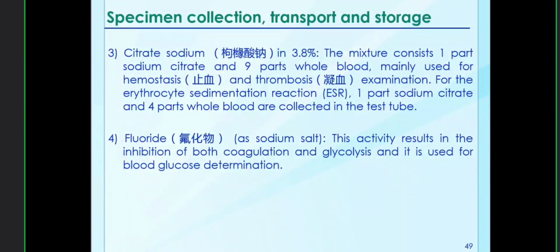Third one is sodium citrate. The mixture consists of 1 part sodium citrate and 9 parts whole blood, mainly used for the hemostasis and thrombosis examination. For the erythrocyte sedimentation rate, 1 part sodium citrate and 4 parts whole blood are collected in this test tube.